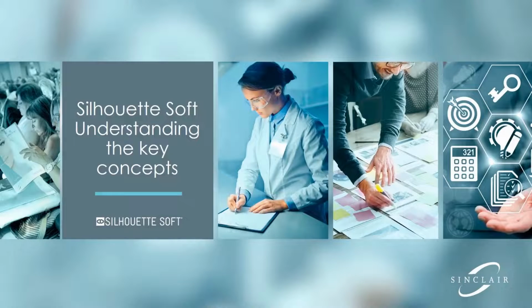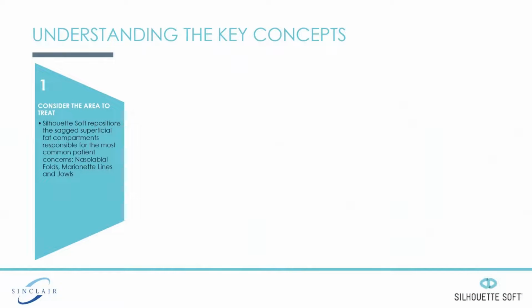Welcome to this Silhouette Soft presentation, which aims to help you better understand its key concepts. There are 5 key concepts that we have to consider when using Silhouette Soft. First, we need to consider the area we are looking to treat.